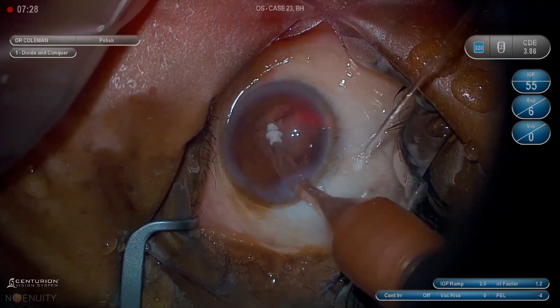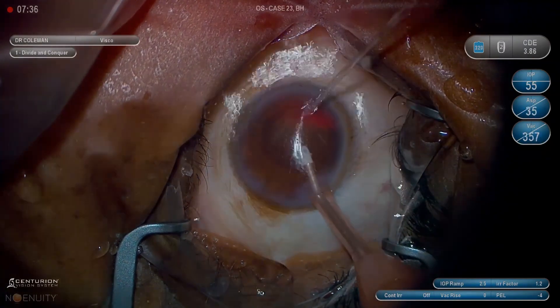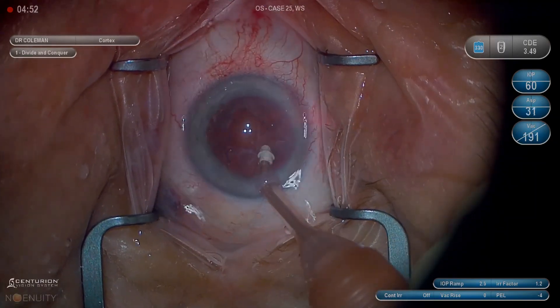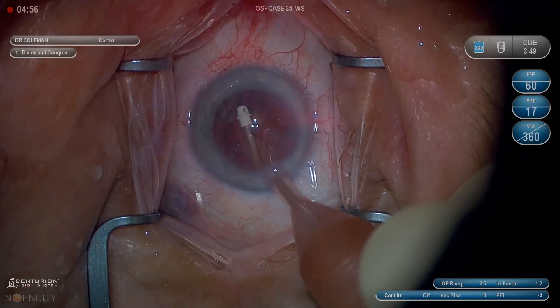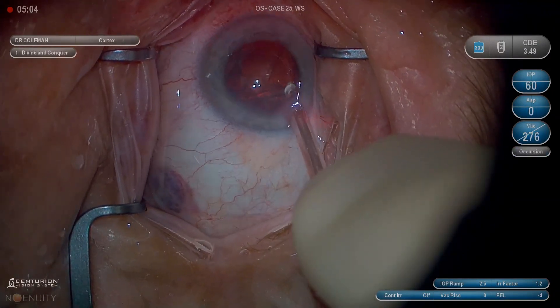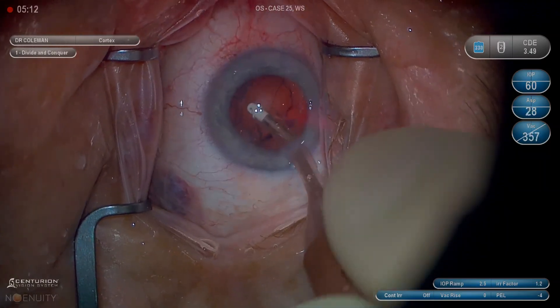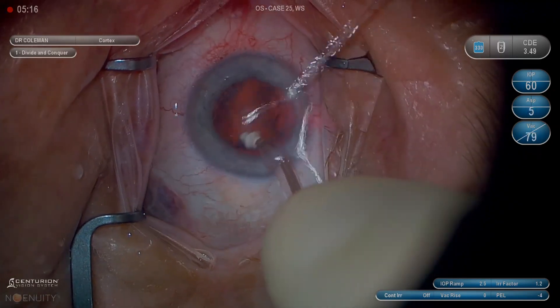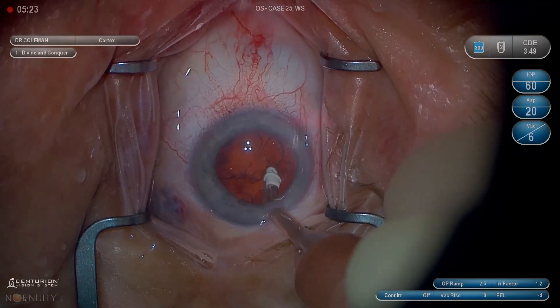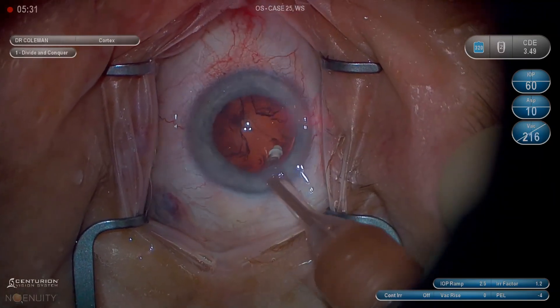Now I'm down to the last quarter, so I have no choice — that's when I slow down a little bit. Polishing is about contact again. I'm planning to take it in quarters; I'm engaging and moving in an arc. Now I'm going to the other side, starting over where there's no clear open capsule behind me. Moving sub-incisional: once I engage and move in an arc I push down, then pull central, then pull up, adding foot as I go. This is a little bit of a problematic shell — almost like an epinuclear shell — and sometimes it is required to do a bottom-up peel.